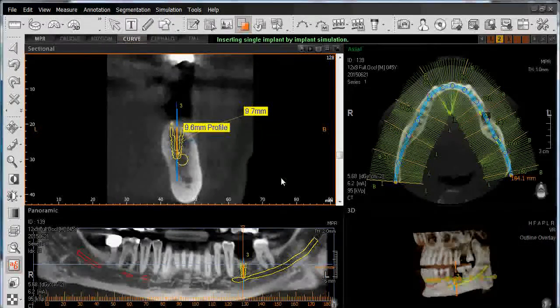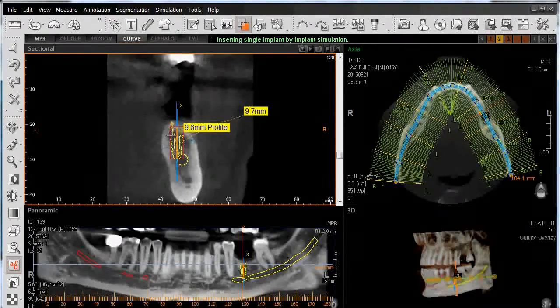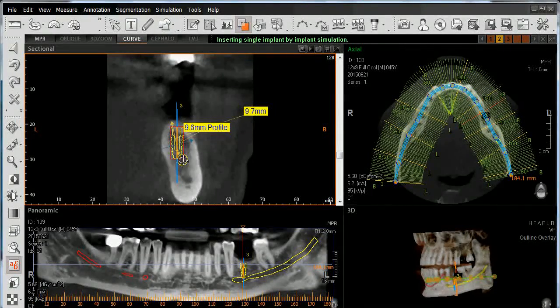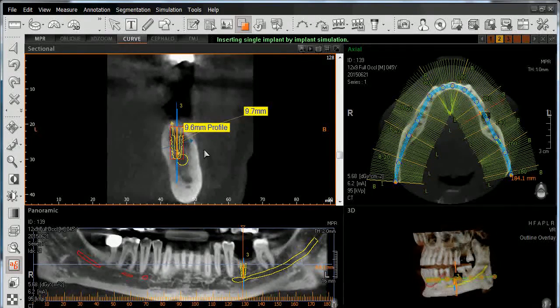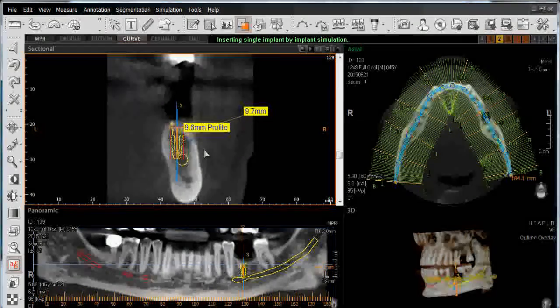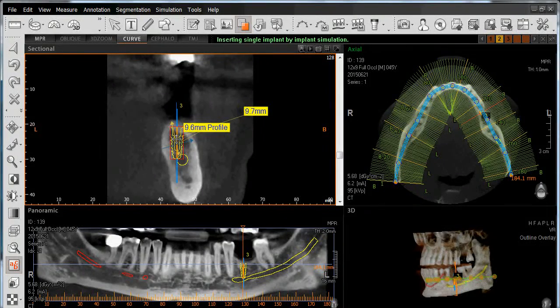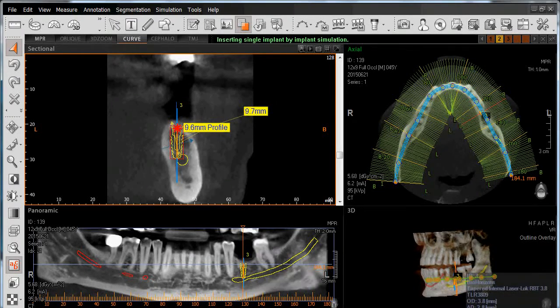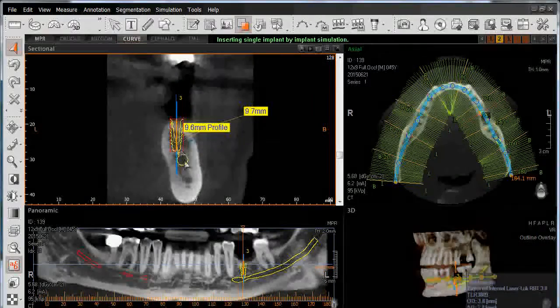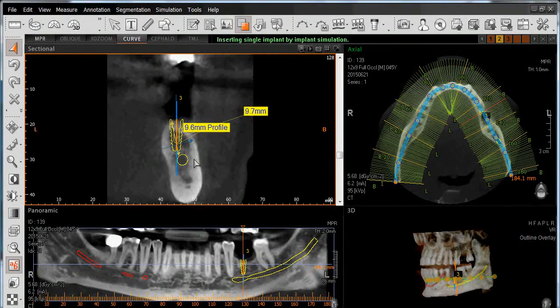Left-click to acknowledge that, and you'll see a red border around the implant, which identifies our safety zone. To move the implant bodily, left-click on the orange line that bisects through the center of the implant, and then move the entire implant system up and out of the way until it's no longer coming in contact with the superior border of our canal.